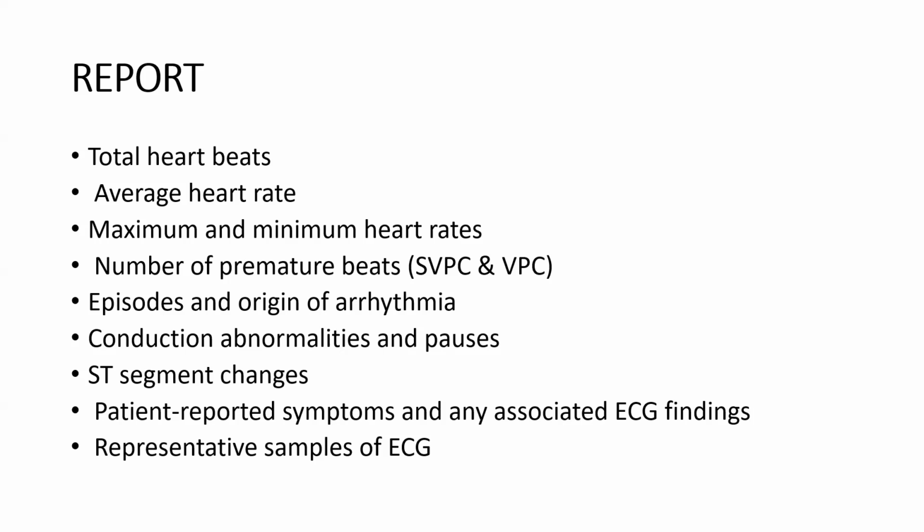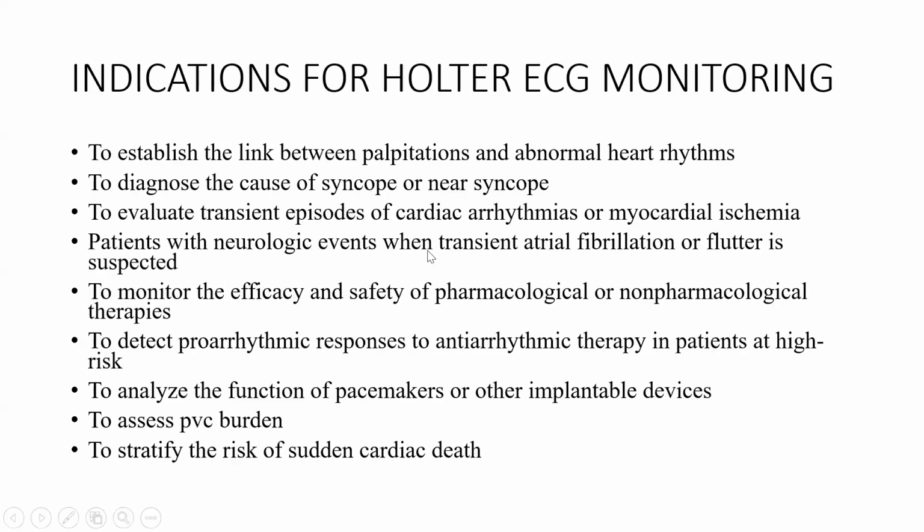It is needed to establish the link between palpitation and abnormal heart rhythm. So this is like symptom rhythm correlation. This would be a positive. So if the patient has palpitation, say every evening, the patient would benefit from Holter, to let us know whether this is just an anxiety state or a genuine arrhythmia.